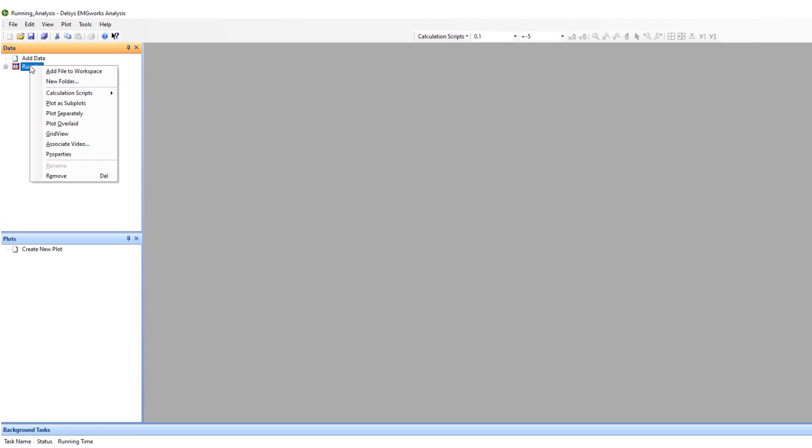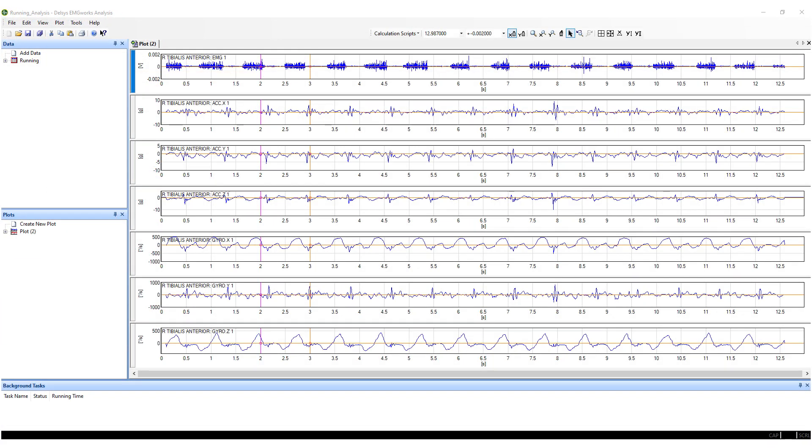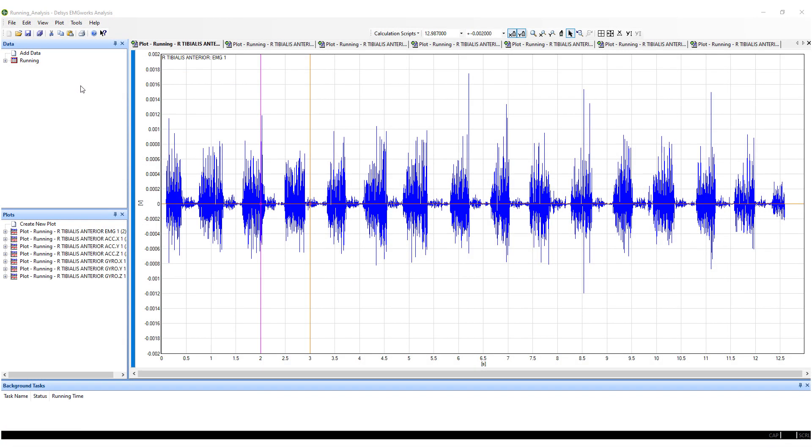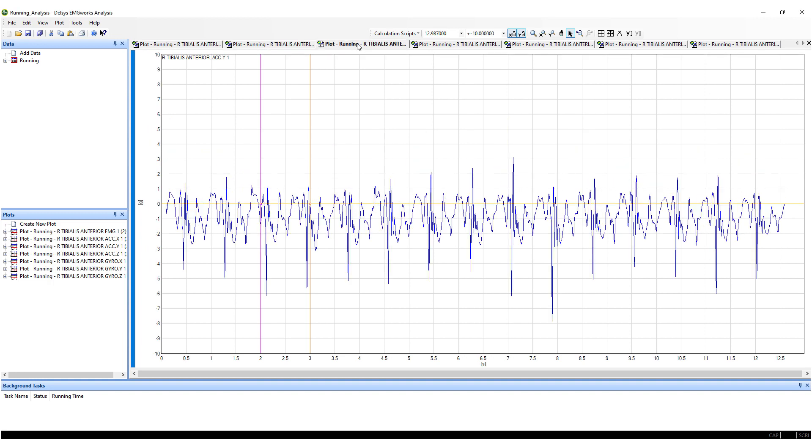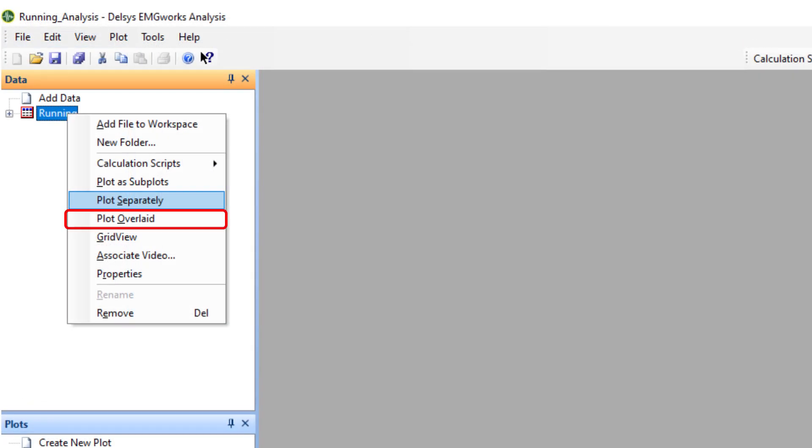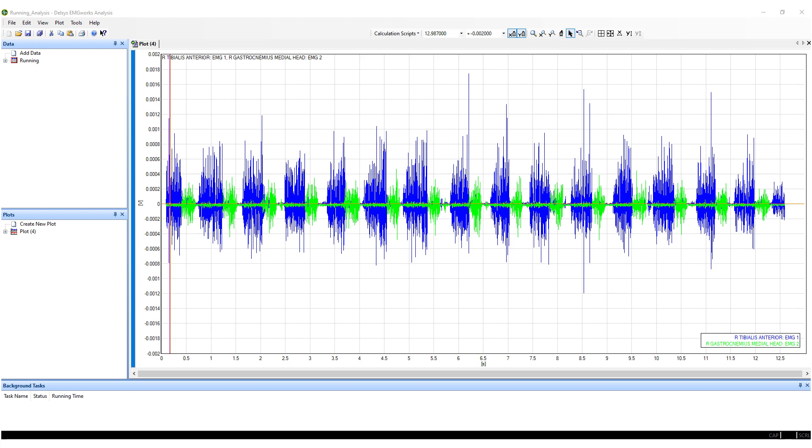Right-click and select either Plot as Subplots, which displays multiple data channels plotted within the same window, Plot Separately, which displays multiple data channels plotted in separate windows, or Plot Overlaid, which displays multiple data channels plotted on top of each other within a single window.